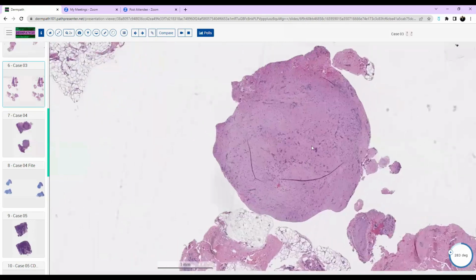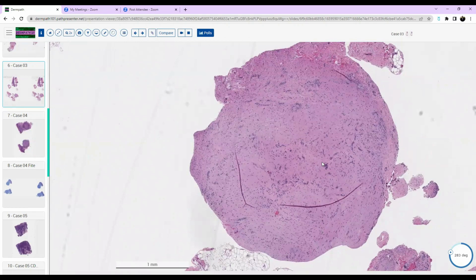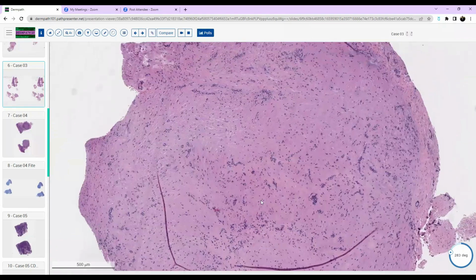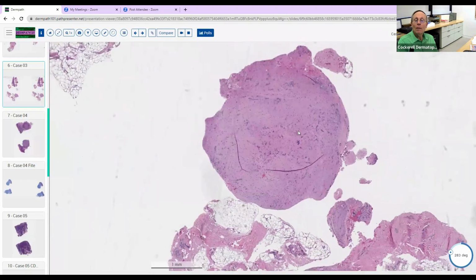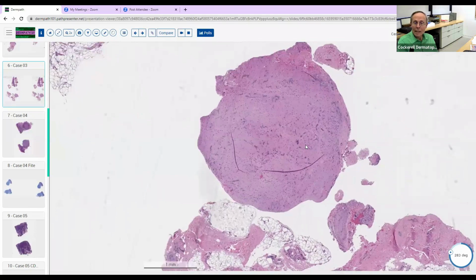Yeah, so you can imagine it may have fallen apart at the time of the procedure. Yes. So do we have this from inflammatory or neoplastic? I was thinking this was a more neoplastic process because we have a very well circumscribed nodule of what looked like spindle cells. Good. Do you think this is benign or malignant, just based on what we have here? Benign. Yeah, benign lesion, very small, round, papular lesion, and neoplasm.